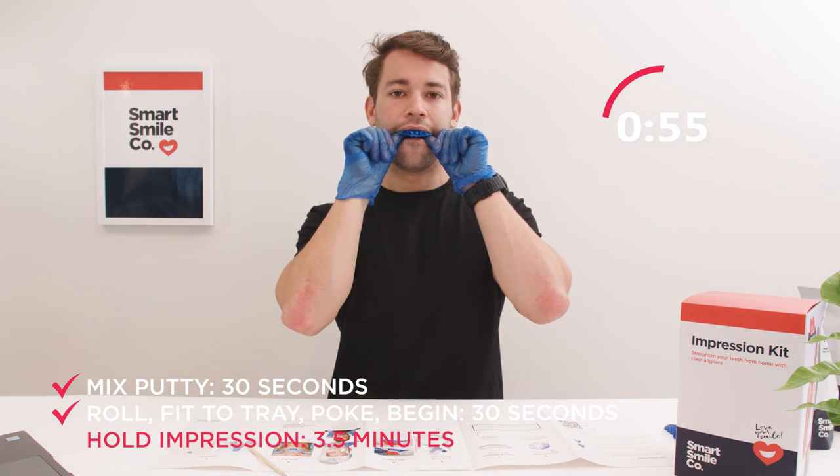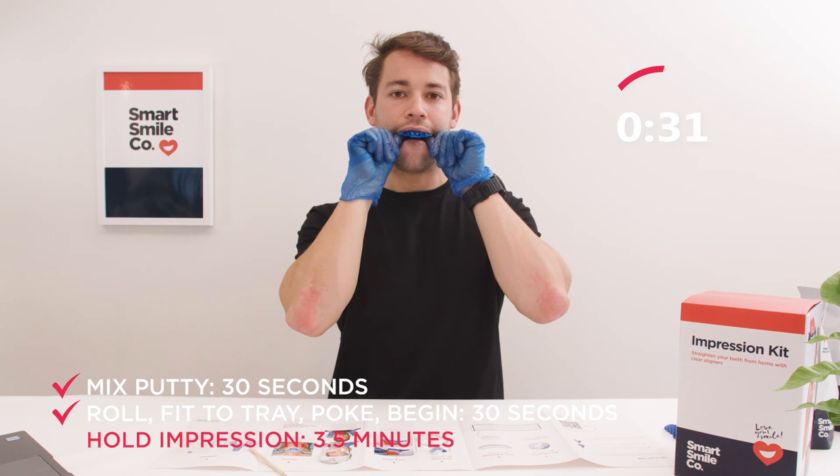Only one minute to go. When the countdown is finished, gently ease the impression out from the sides. Don't only use the front handle.